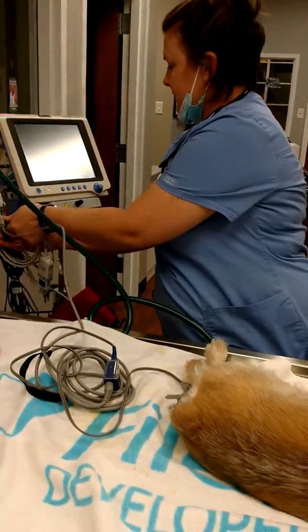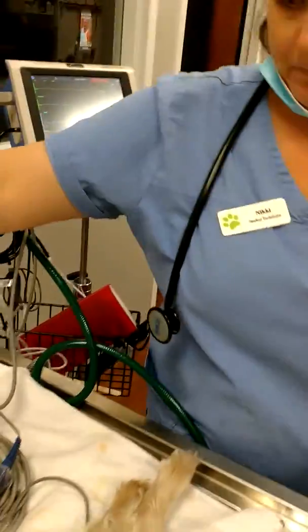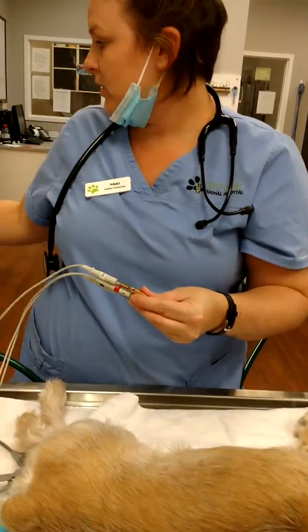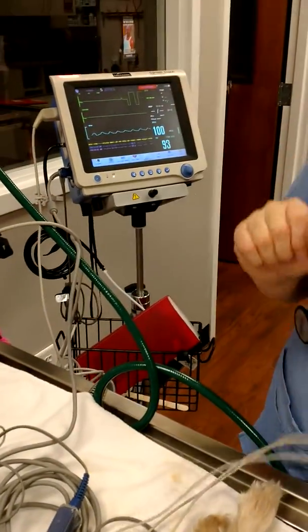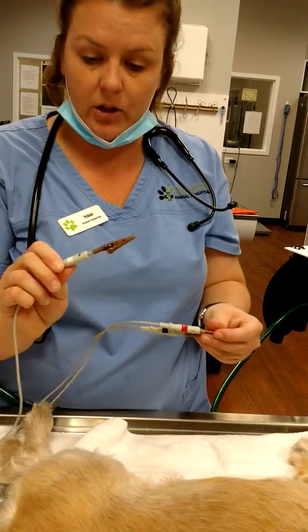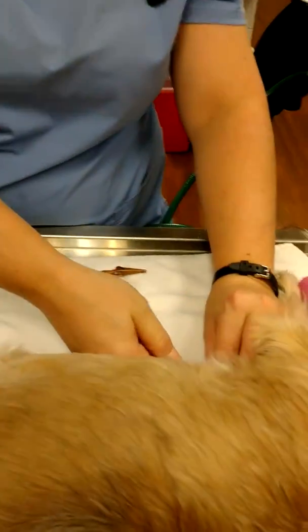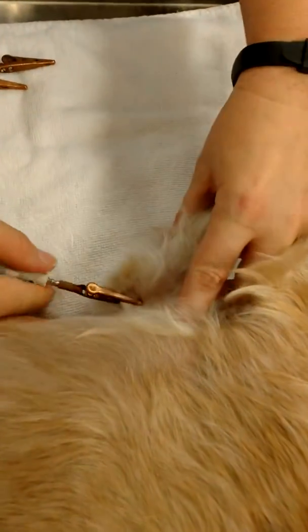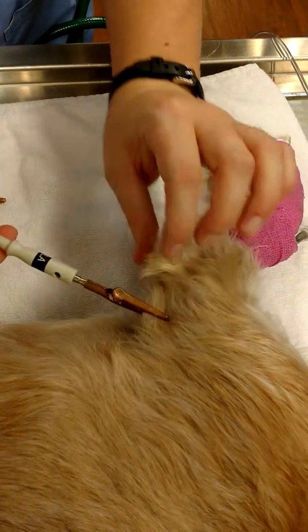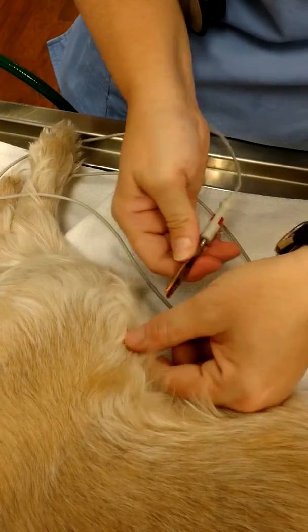Next, we get an EKG arm. This is going to show the electrical activity of the heart. These leads actually tell you what goes on what arm. Most people know them by 'white is right,' so that's going to stick right proximal to the elbow. Then 'smoke over fire,' so this goes on the left arm, and then your red, which is the fire, will go on the left leg.